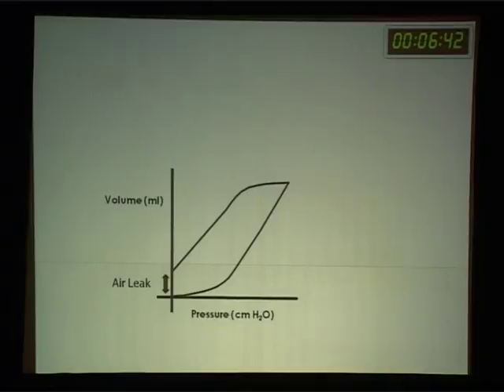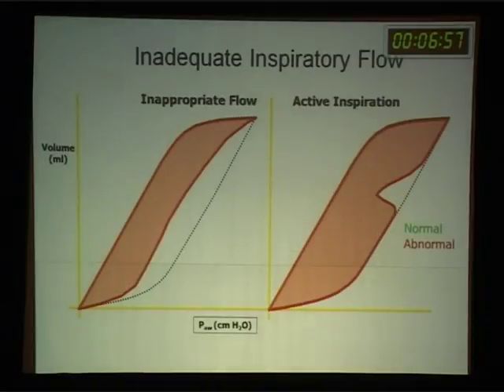Okay, so these are just quick examples of what graphics can tell you. It's not possible to cover the whole graphics in a 20-minute talk, because graphics are actually advanced mechanical ventilation topics.